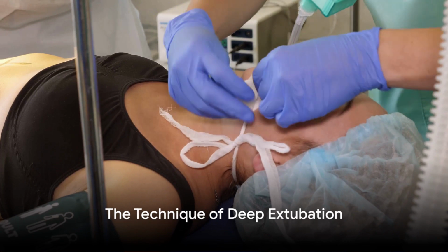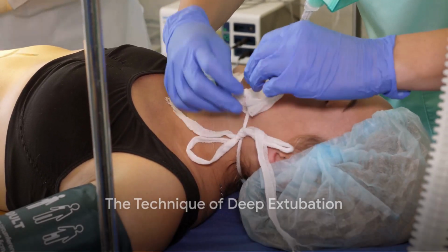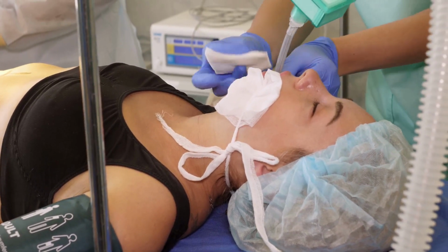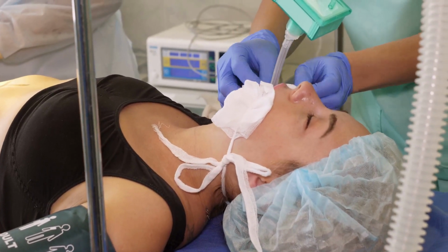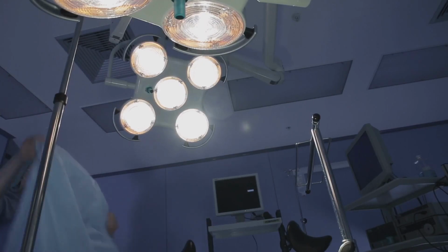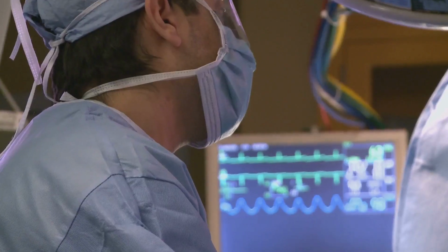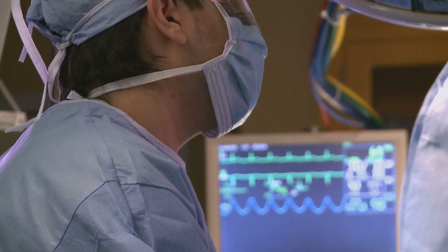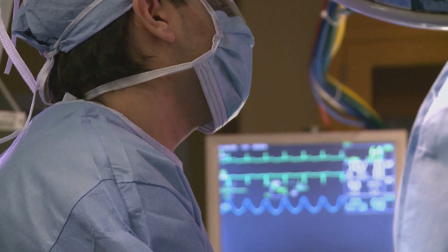Now, to the technique itself. Deep extubation requires careful monitoring and preparation. Start by ensuring the patient is in a deep plane of anesthesia. This is crucial to prevent any reflexes that might cause complications. Then, the anesthesiologist must verify that the patient has adequate oxygenation and ventilation.